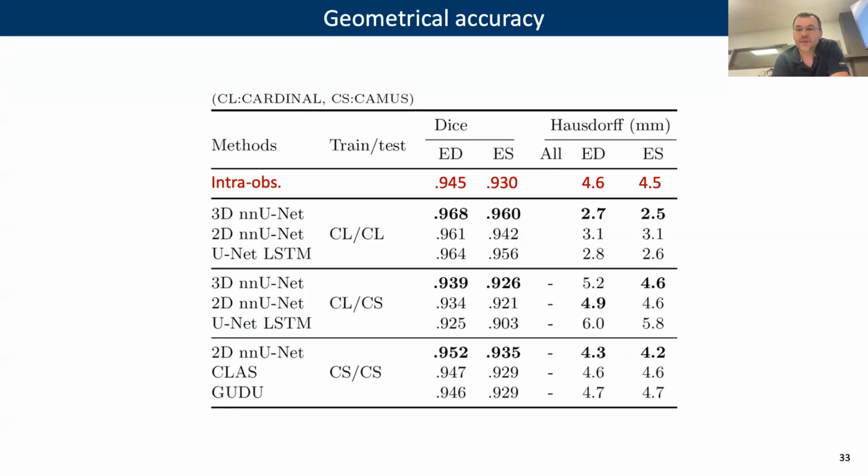So this confirms to us that this is the way to go, that thanks to our post-processing, doing a gold standard on a large-scale data set and learning from that allows us to handle different kinds of distribution of data, depending on the vendors, depending on whatever you want, and that we will be able to solve the problem of segmentation in echocardiography.